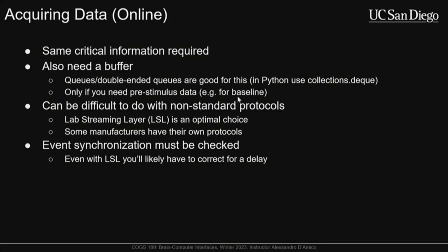But we often want activity prior to a stimulus that has no information, this baseline activity, which is just the brain doing its thing. And we want to take the average of that baseline activity and subtract it out from our main signal in order to zero everything. And I have a figure for this that'll make it more obvious.